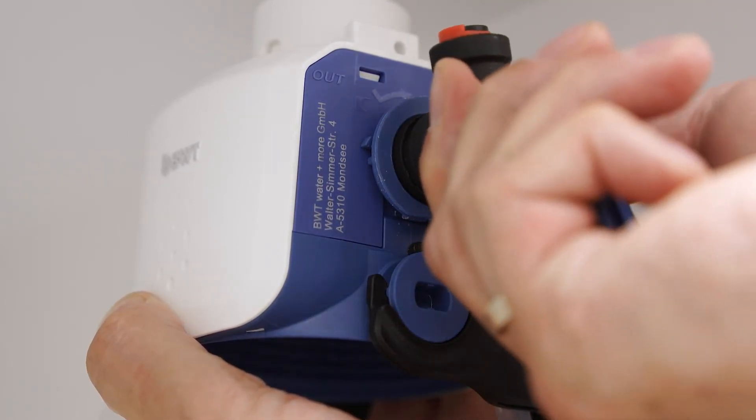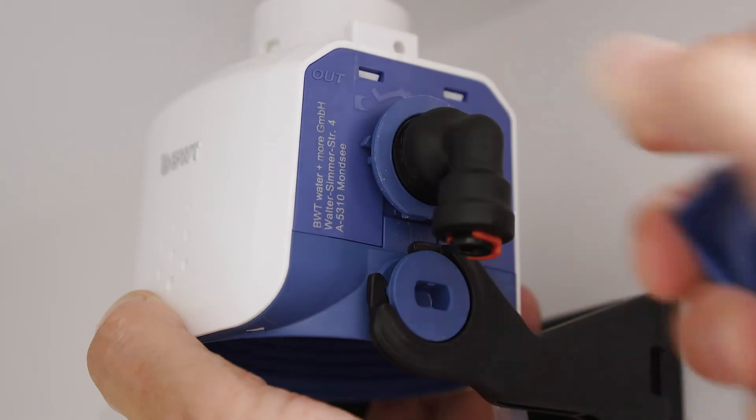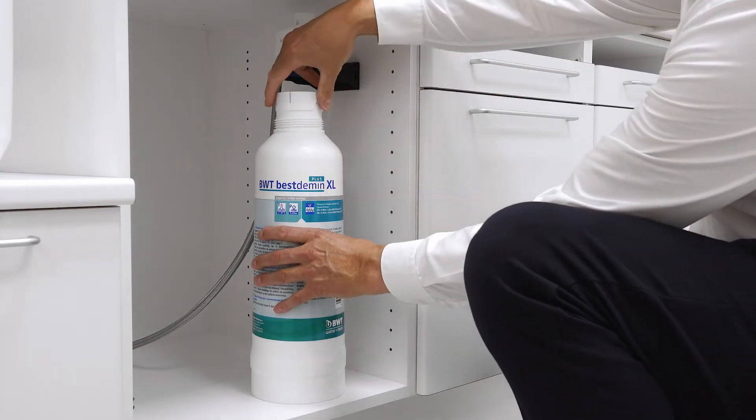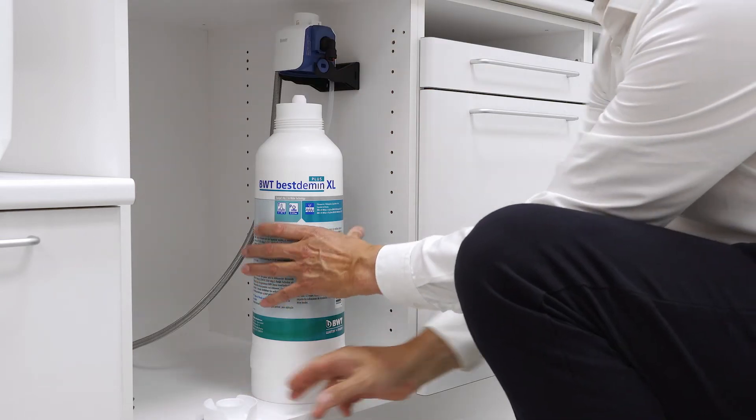The direction of the elbow can be adjusted as you wish. Before inserting the Bestdemin filter, remove the dust cap and screw the filter into the filter head.